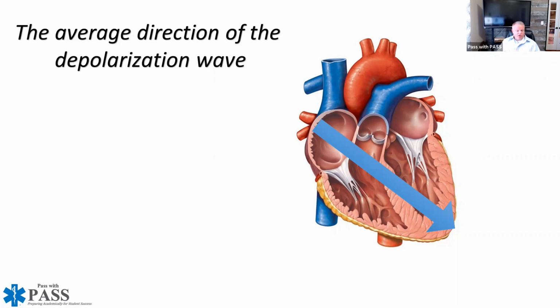And then the AV junction allows the electrical impulse to go down towards the ventricles. And remember that the heart is seated in the chest, and it's tilted just a little bit. So under normal conditions, the heart is depolarizing from the right upper to the left lower, much like the arrow was showing you. And this will become important as we talk about the normal flow for axis.